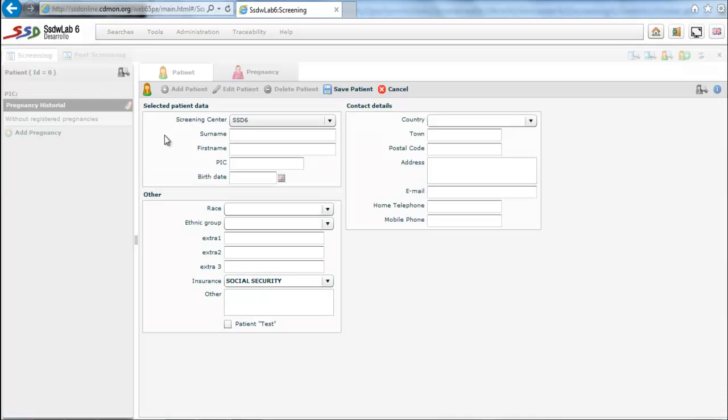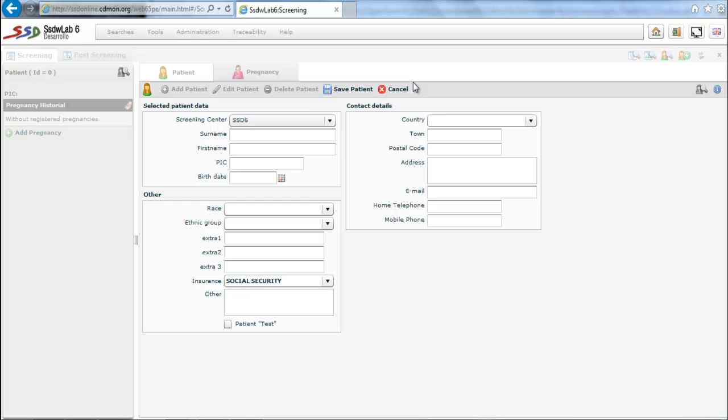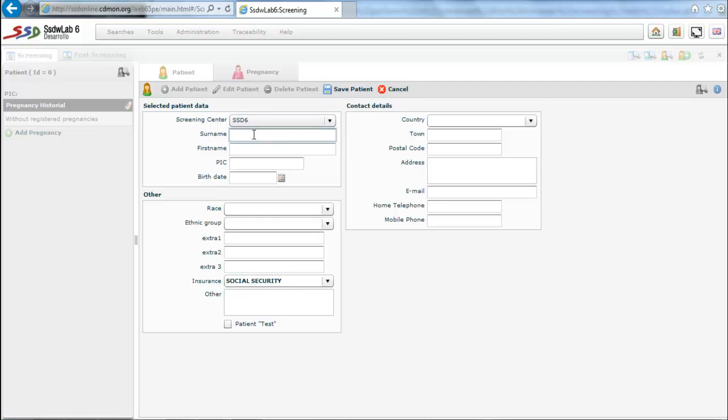The first folder of the screening that appears is the patient's folder. We notice a series of edit buttons just below the tabs of the folders that allow us to add, edit, delete, save, and cancel. These buttons appear on all folders as we will see.